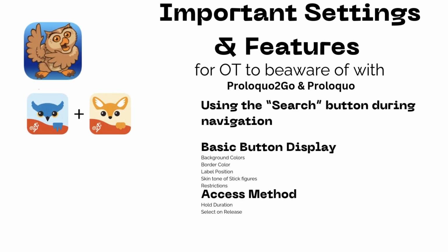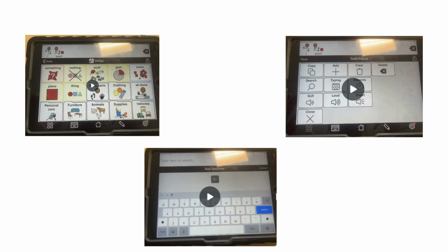So now we're going to explore some important settings and features of Proloquo and Proloquo2Go. First, we'll be using that search button during navigation, basic button display, and access method. In a session, there may be times where you want to model with the device but can't find the word. So the next example we'll be going over is using that search button.